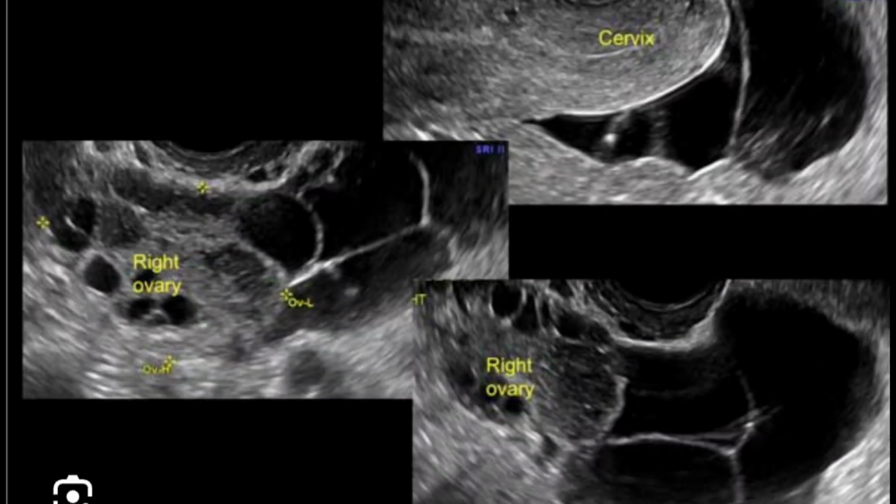The one is incomplete septa adjacent to the ovary, and there is an enlarged fallopian tube. Actually, this anechoic structure with incomplete septa is a dilated fallopian tube. So in this fashion, you can appreciate a well defined dilated enlarged fallopian tube filled with water, filled with serous fluid, filled with some other exudative material.